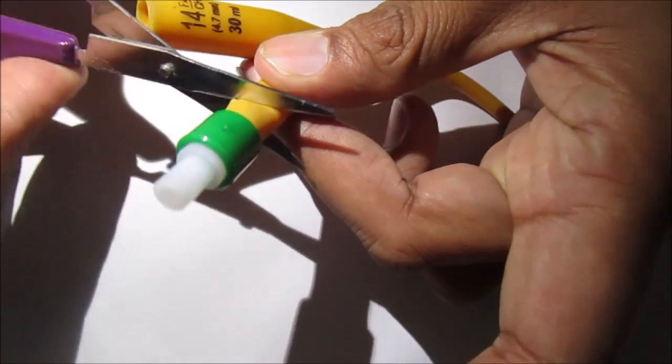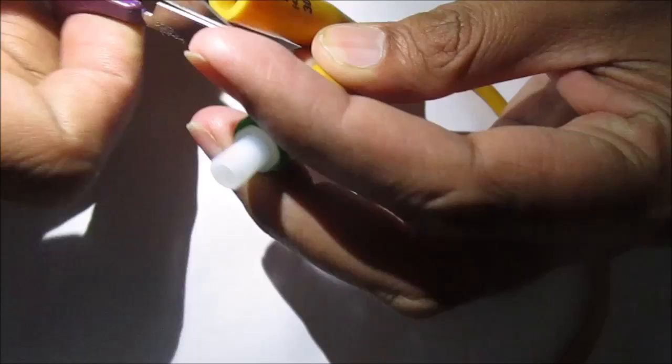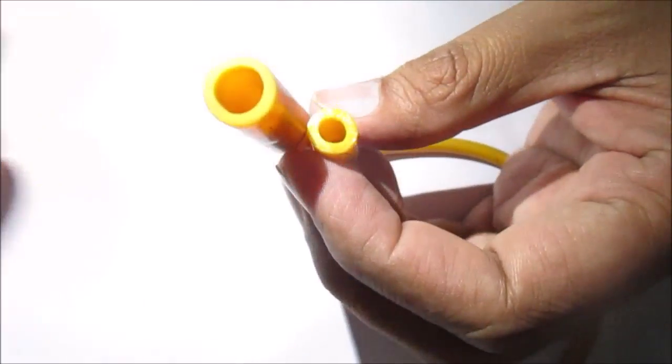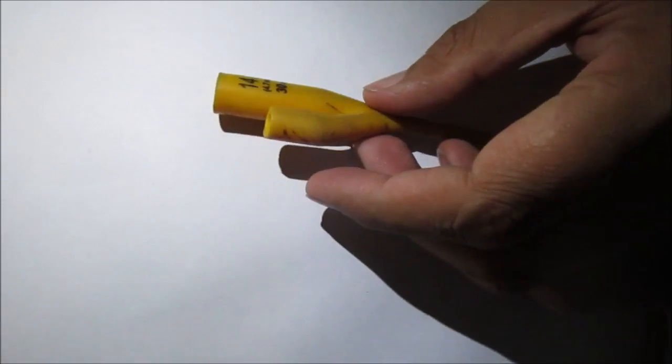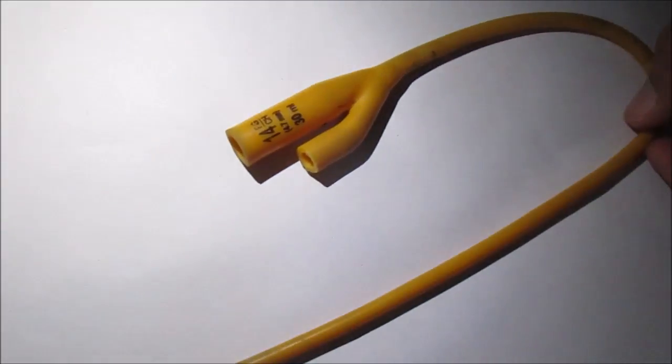And if it is still not working, you can puncture the balloon from percutaneous, transvaginal, transperineal, transrectal, or transabdominal approach.